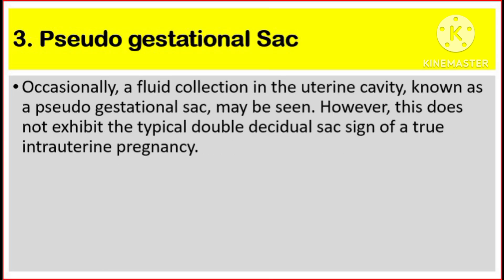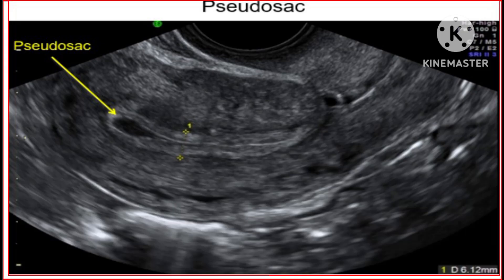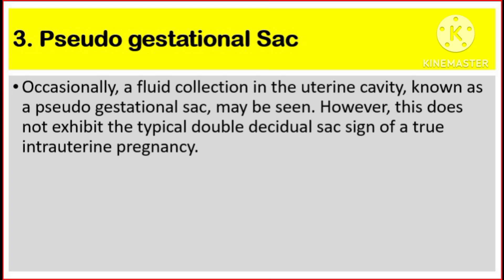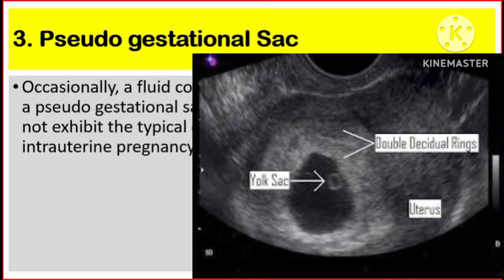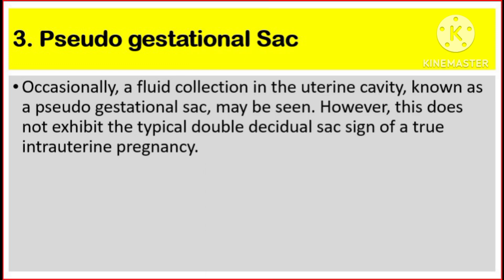Number three, pseudo-gestational sac. Occasionally, a fluid collection in the uterine cavity known as a pseudo-gestational sac may be seen. However, this doesn't exhibit the typical double decidual sac sign of a true intrauterine pregnancy.